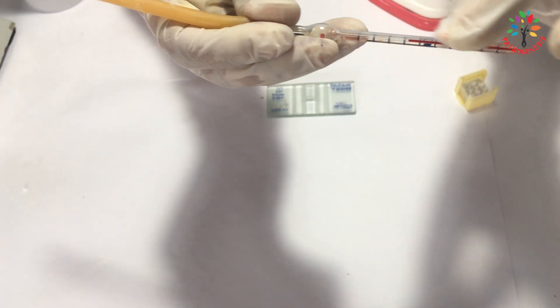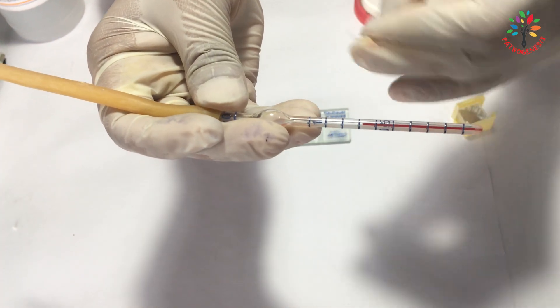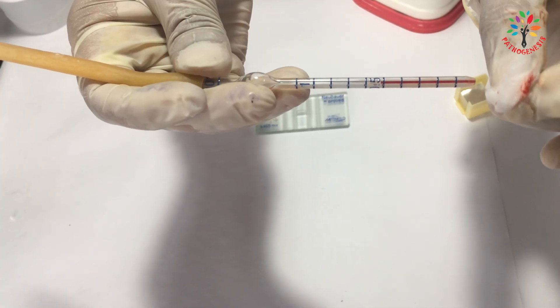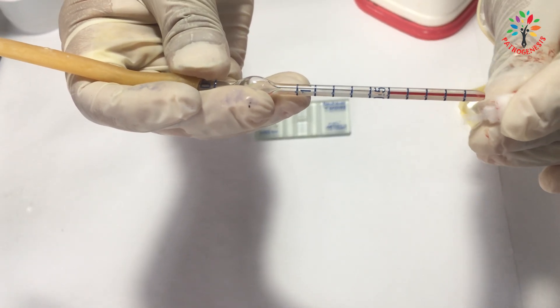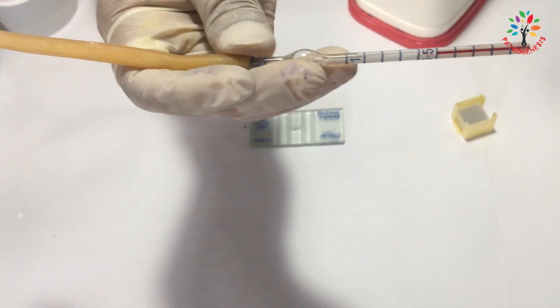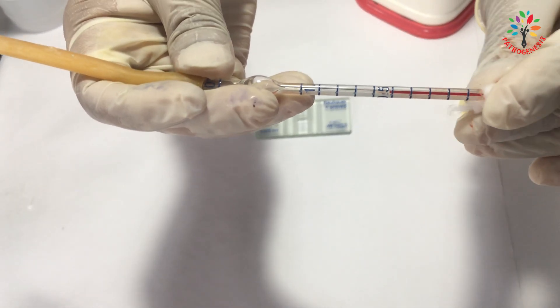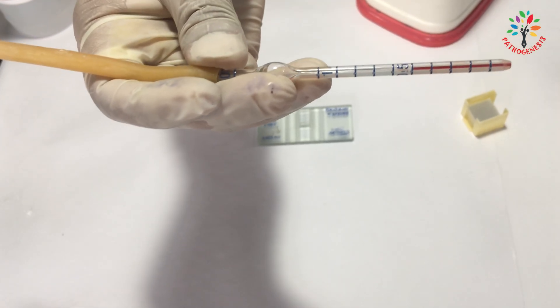At this point, some students face difficulty filling the blood exactly at 0.5. Here is a tip: draw the blood sample beyond the 0.5 mark in the RBC pipette. After that, take some cotton and gently touch the tip of the RBC pipette to adjust the blood down to the 0.5 mark. When you touch the tip with cotton, because of capillary action, the cotton will absorb some blood and you can adjust it to exactly 0.5.